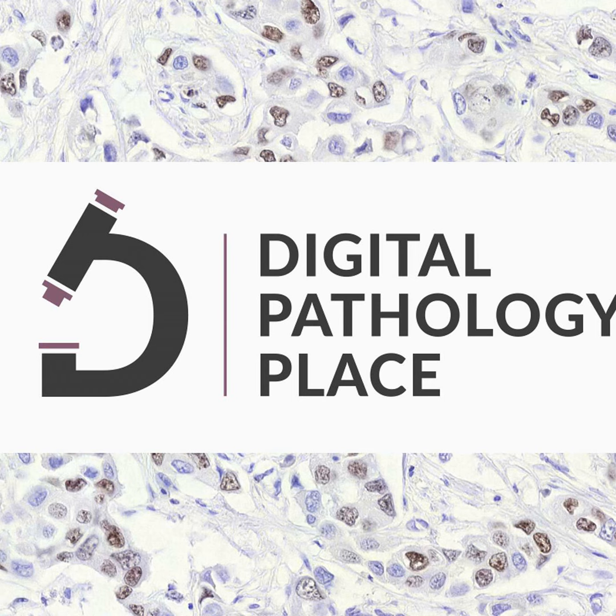They order a study. Then step number two is you've got to schedule the patient, you've got to schedule the scanner. Step number three, you scan and acquire those images. Step number four, after the images are acquired, it goes off to a system. For us, it's a PACS system where we review those images and open up the study through a work list. So what is the order of that work list? Then, when I open it up, how do I get information about the patient and the history? Then finally, I get to the point where I'm actually looking at the images. There have already been 5 steps before that, yet everyone was concentrating on this one area of detection, diagnosis, and quantification of things on the image.